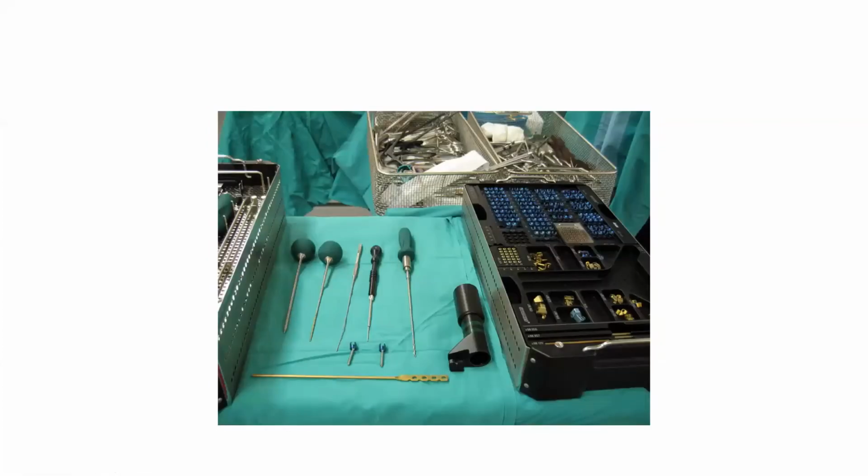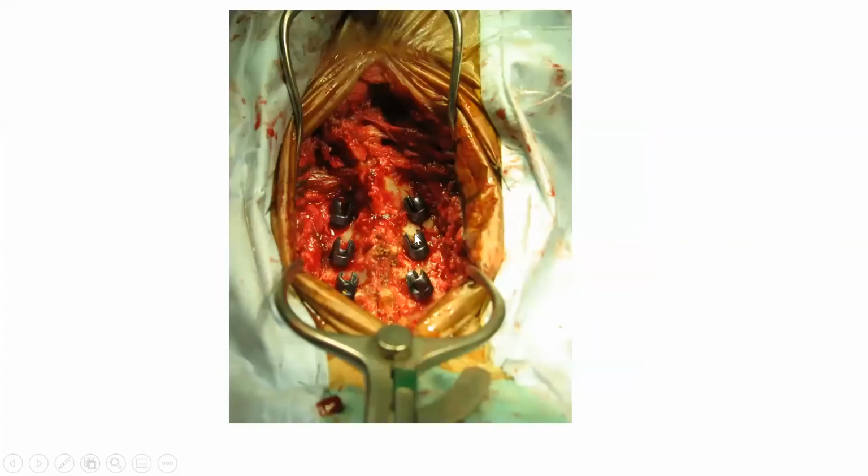This is a typical set that comes with it. These are lateral mass screws in the fluoroscopy, parallel with the facet joints. And there you can see the screws in.